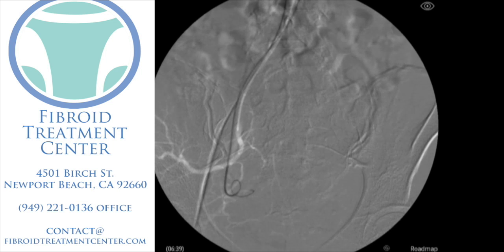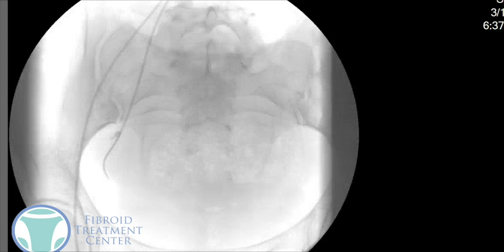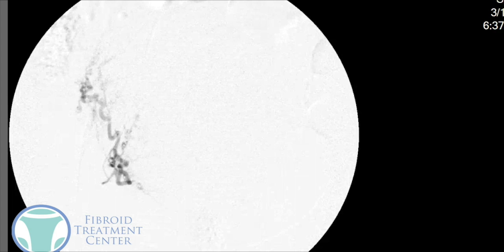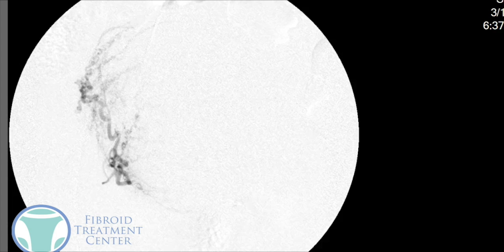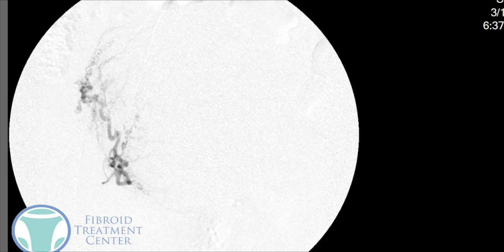Then we're going to put the catheter over that wire. From the right side of the pelvis, we're going to take an x-ray, inject that dye, and take the x-ray. We'll see again — similar to the left side — a large uterine artery with all those smaller little curly arteries going into the fibroid and feeding it. You can almost see the other half of the fibroid compared with what we saw on the left side.